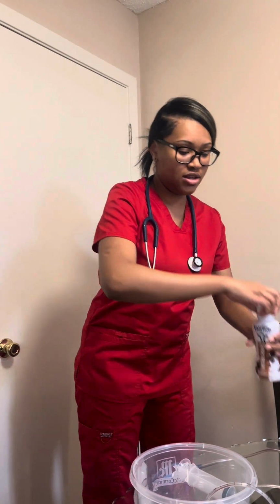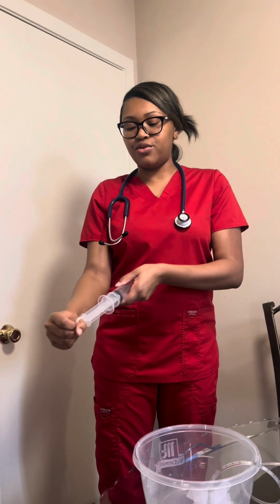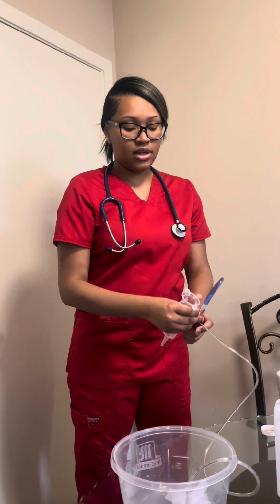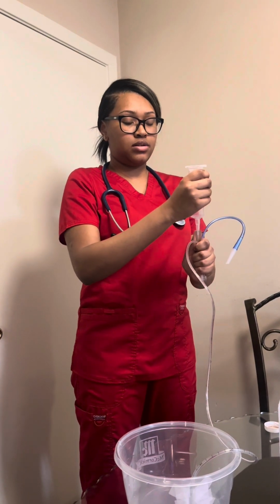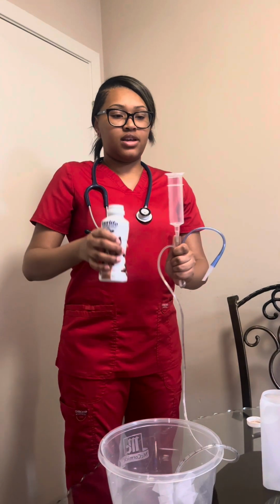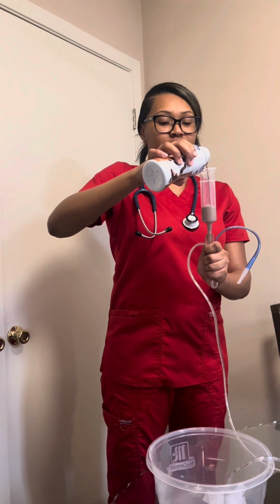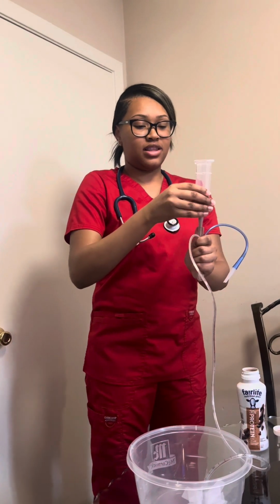And then I would remove the plunger, clamp this, and then I would just fill this up and let it flow.